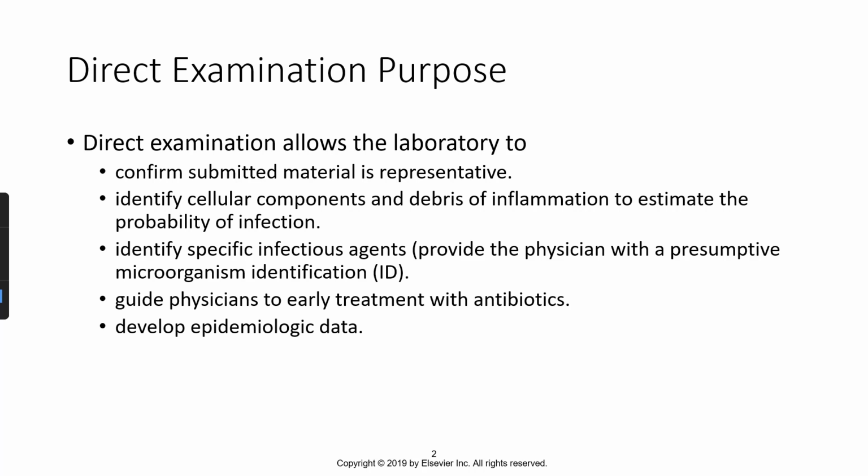Also, being able to determine whether a specimen has to be rejected or not. So if the specimen has too much contamination with healthy tissue or surrounding tissues or normal flora, we want to get that information up to the floor right away so that they know that they have to recollect the specimen immediately. Sometimes patients are discharged and we don't want to have them come back to the hospital to allow us to do those tests another time.